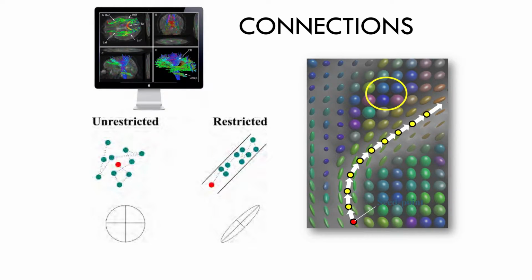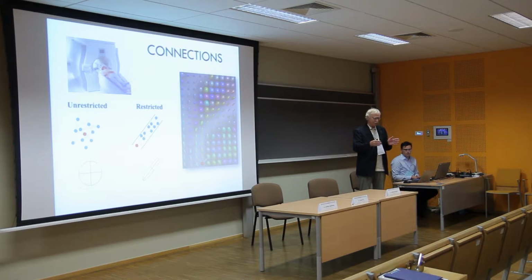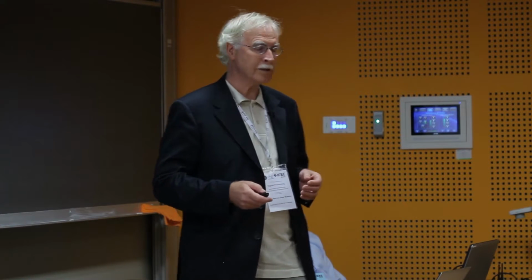Water makes Brownian motions. It's constantly bumping into other molecules. And actually you can measure this diffusion process, this Brownian motion, with an MRI scanner, because if you make a high gradient, so you have a 3 Tesla scanner, and here it is 3.1 and here 2.9, if these molecules move a little bit in this direction, they change, even if it is nanometers, they change a small magnetic field, and they change frequency. These frequencies can be measured.